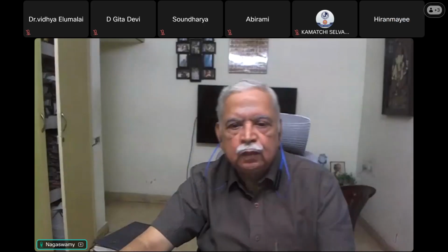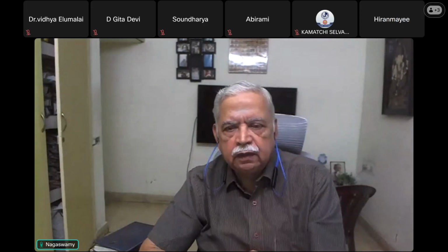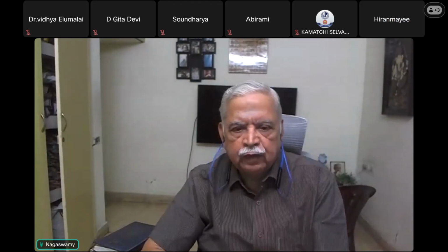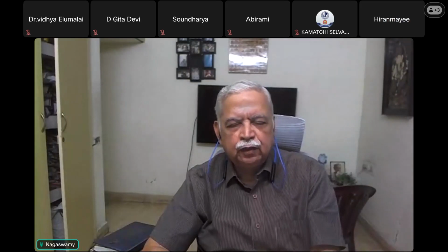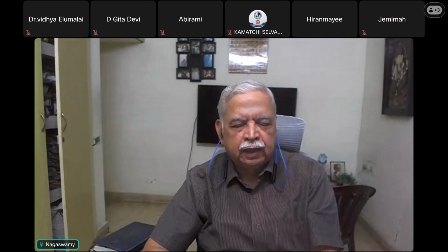So these are the things that we have to keep in mind to ensure that you are able to interpret these patterns in the exam correctly. Remember the pattern for obstruction is FVC reduced, FEV1 reduced, FEV1 to FVC ratio reduced, TLC normal. This is obstruction.